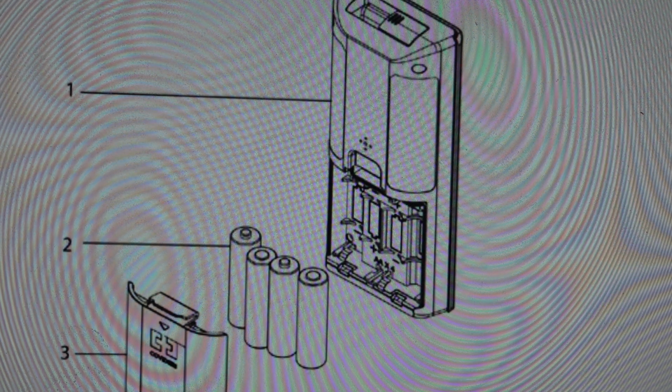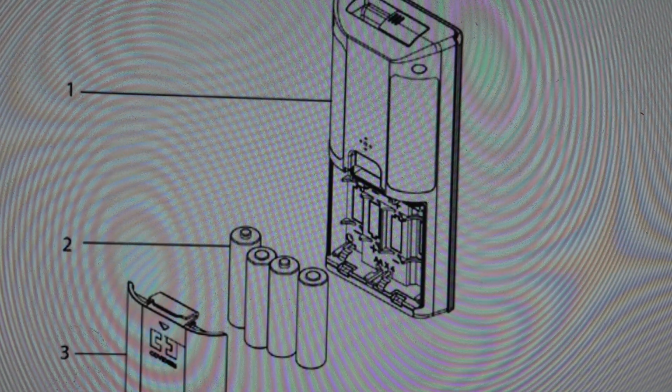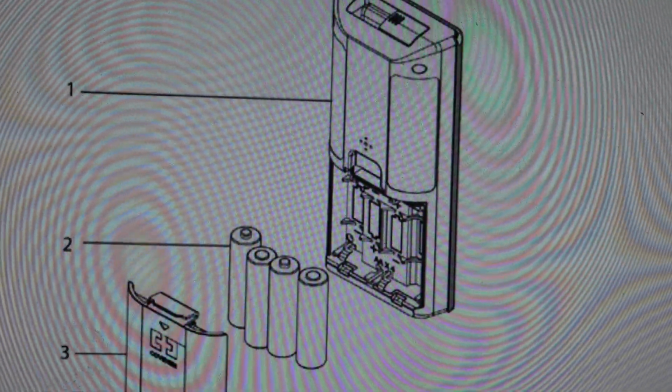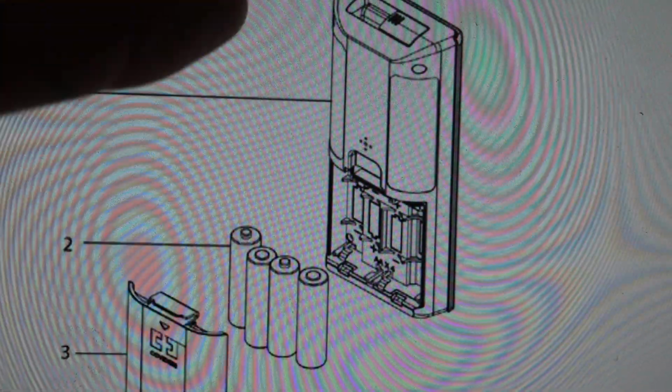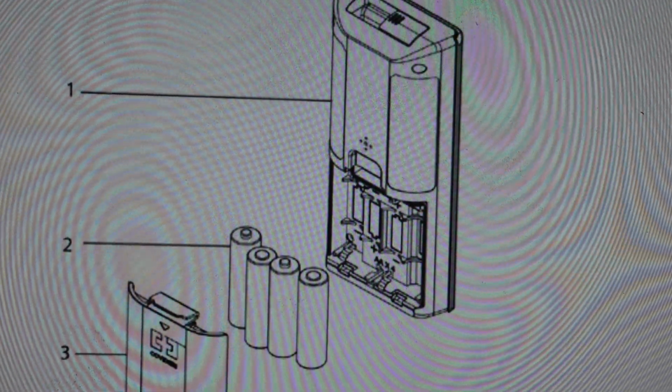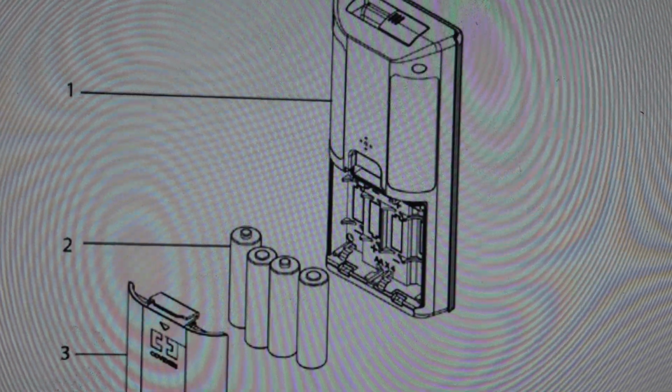Once you have them, you need 4 of them. You're just going to come in on the back of the machine with it turned off. Turn it off first, and then just push down this little tab on the top of the battery case, and it will pull the old batteries out, and then just put the new batteries in, going plus side up, plus side down, plus side up, plus side down. And then you can go ahead and put the case back on.